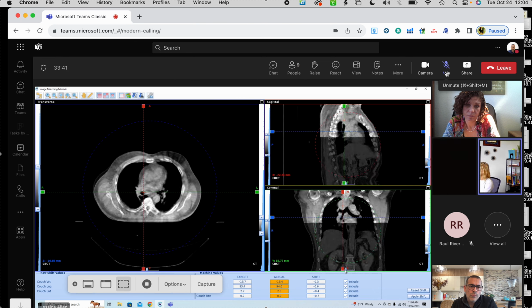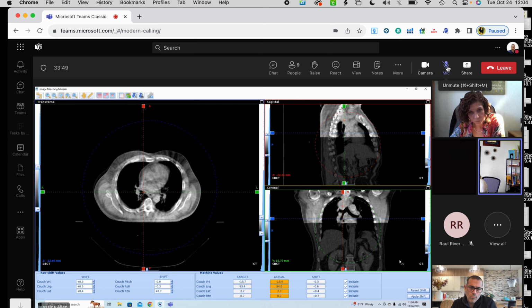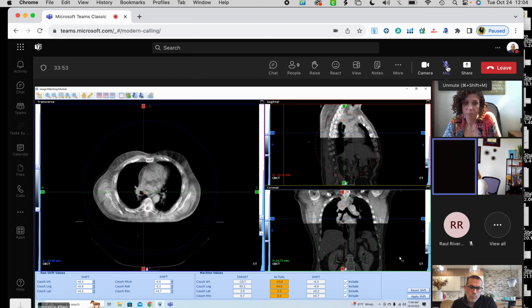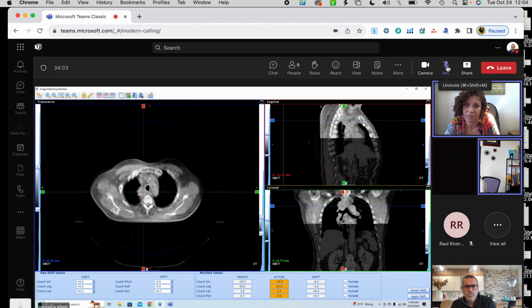Oh, I'm gonna agree that part of it was the arm placement, but even if the arm placement's bad, how do we make this a little bit better of a match? Well, if we're treating the right, then in clinic, what I would do is split the difference, but closer on the affected side and not the contralateral right side.